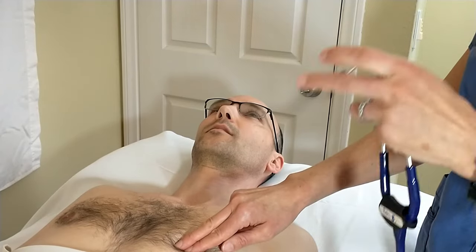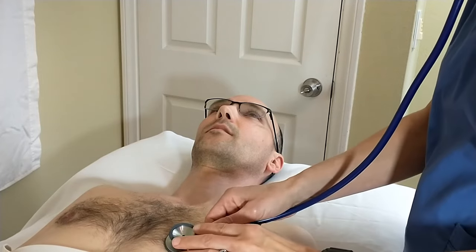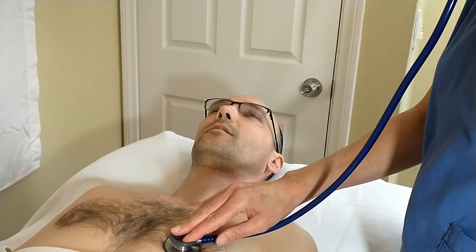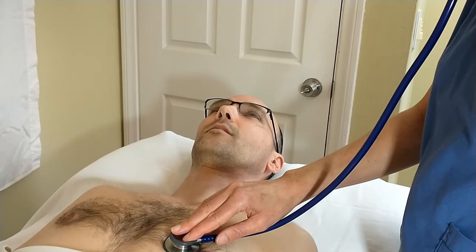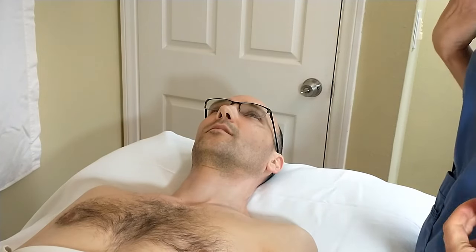So I take my stethoscope and I place it right there on that apical site. And I listen to it for a full minute while I count it. After I'm done counting for a full minute, I know that this is my patient's apical heart rate.